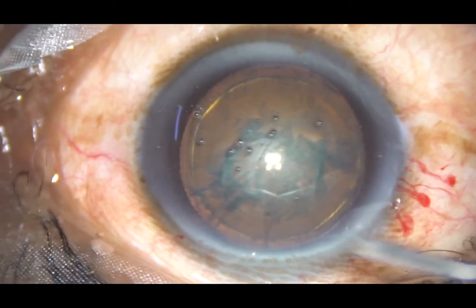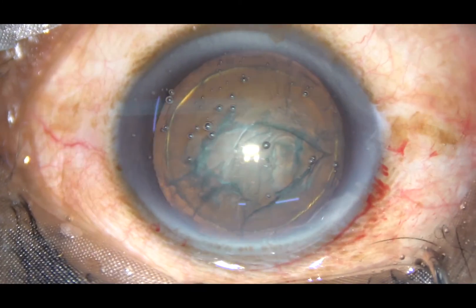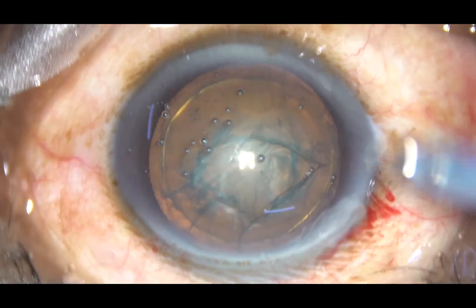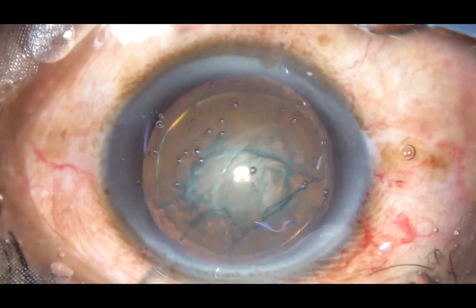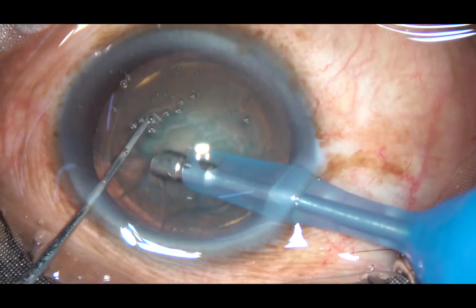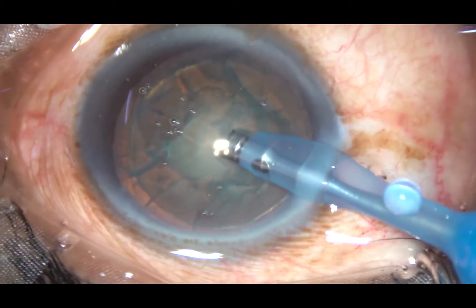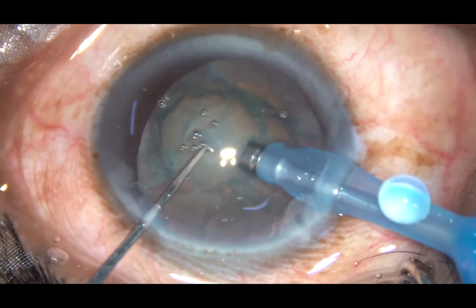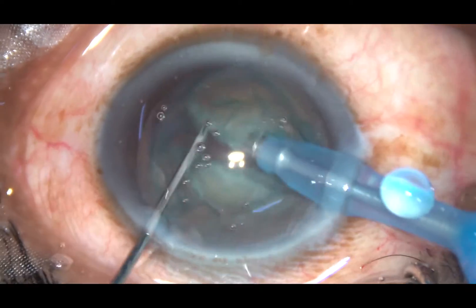Since this is a cataract of grade 2+ or grade 3 nuclear sclerosis, chopping this nucleus is very easy. I just have to hold the nucleus with high vacuum and chop it. The chopper in my left hand is a modification of a Sinskey hook — a chopper designed by me and manufactured by a local manufacturer.